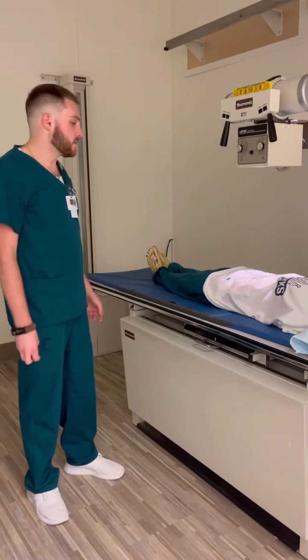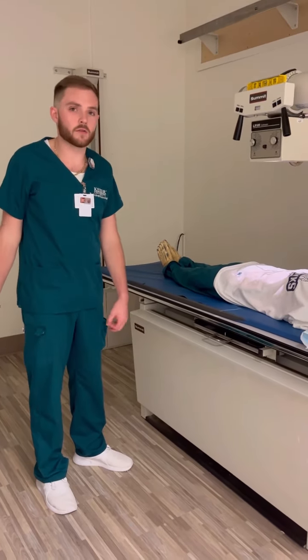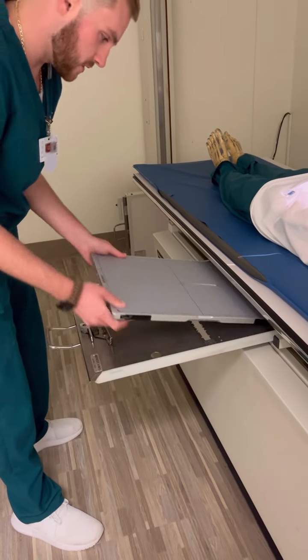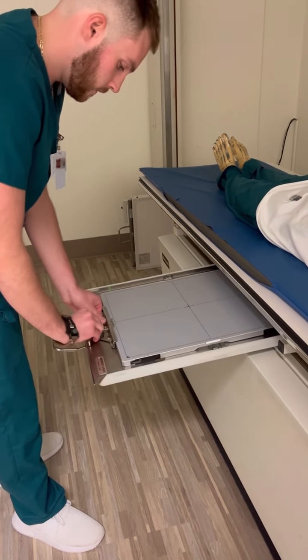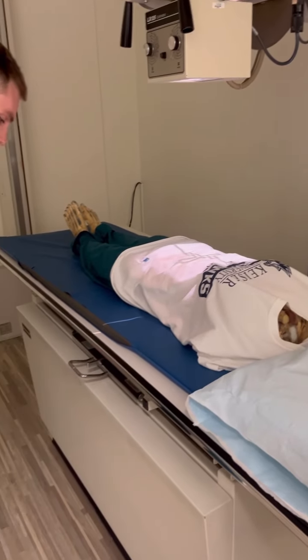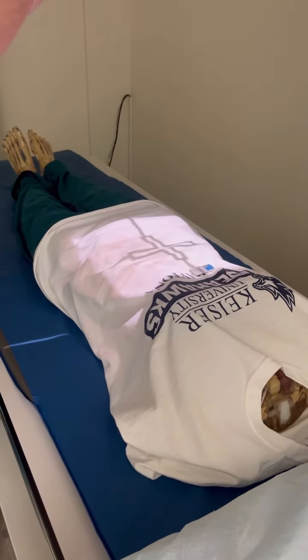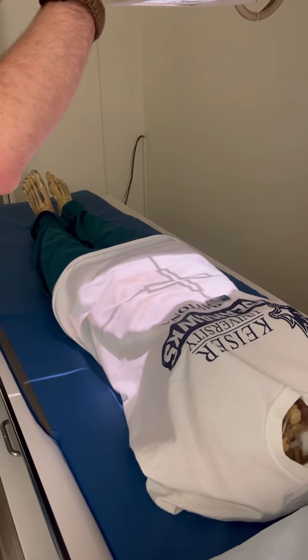Alright, so now that we've done the lengthwise part of the T shot, we're going to get ready to do our crosswise, and we're going to create some overlap for this. So first things first, we're going to take our IR out, and we're going to make sure it's in crosswise orientation. There we go, make sure it's still aligned to the tube. Looks perfect. I'm going to take my marker, and I like to put it at the top of the light field. I'll collimate to a 14 by 17 crosswise image now instead of lengthwise.